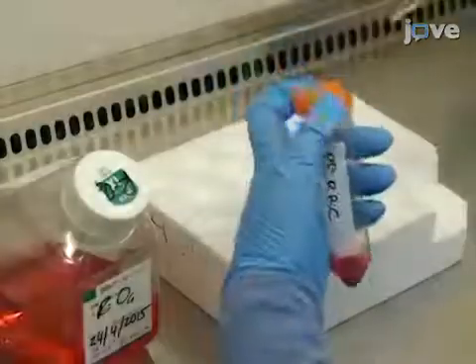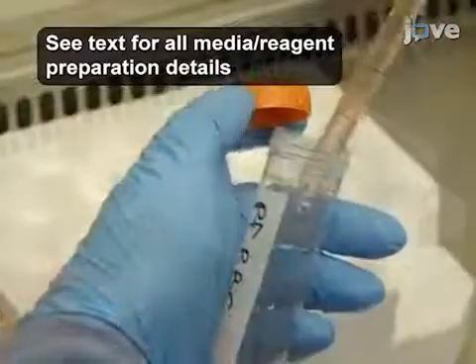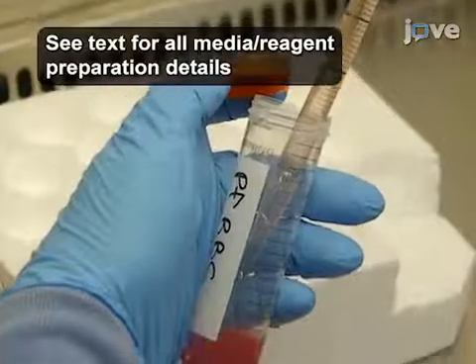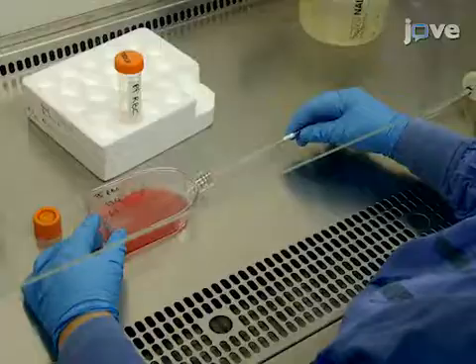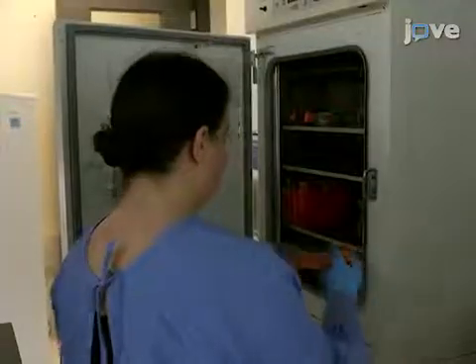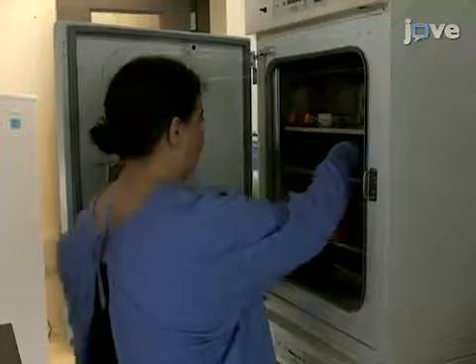After 15 minutes, spin down the cells in RPMI-0 two times, adjusting the hematocrit to 3% in RPMI-A after the second wash. Then gas the flask and return it to the 37 degrees Celsius incubator until the trophozoites reach a 5-10% parasitemia.